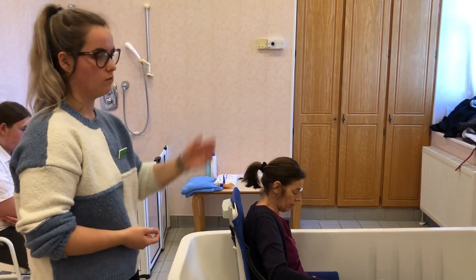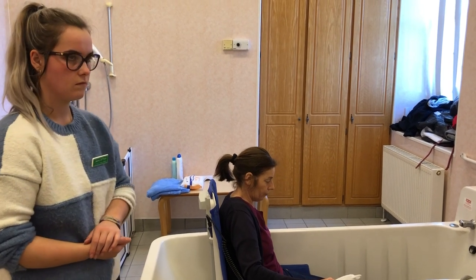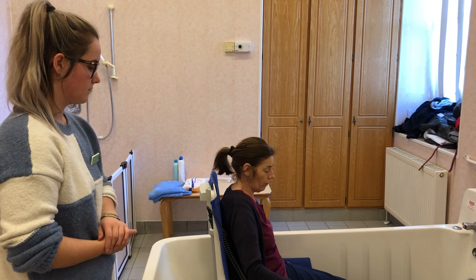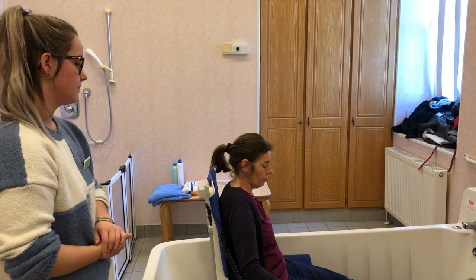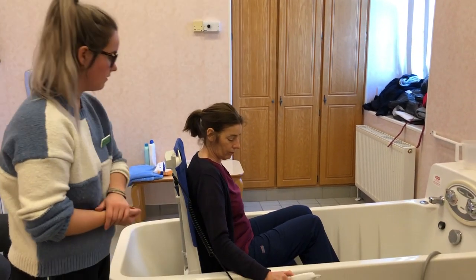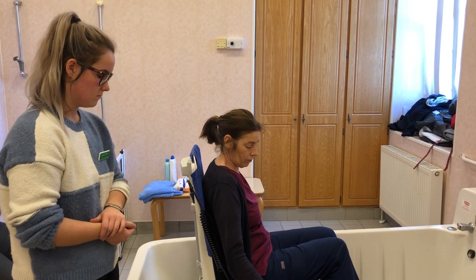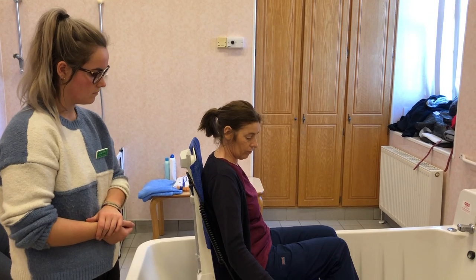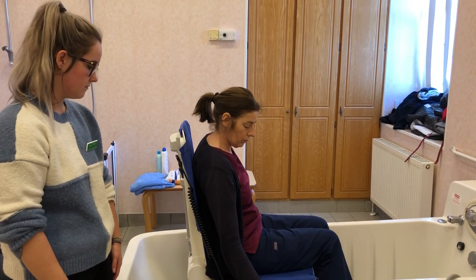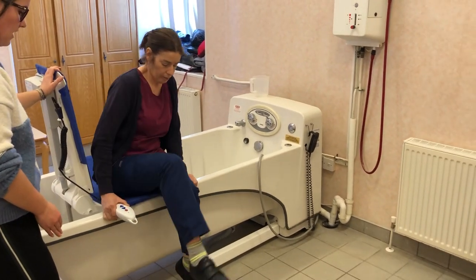When coming back up, the backrest always moves first and then you start to come up. Wait for the seat to come all the way up, then swing one leg out and then the other. Move all the way up, open the steps to the edge, and then you can stand up from there.